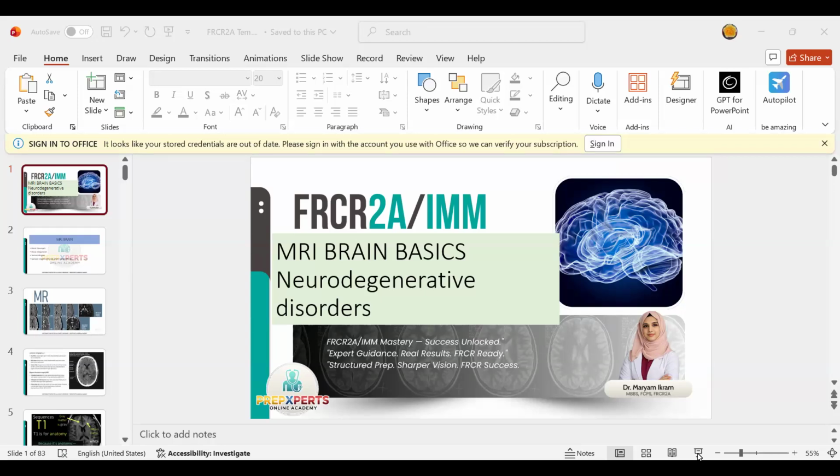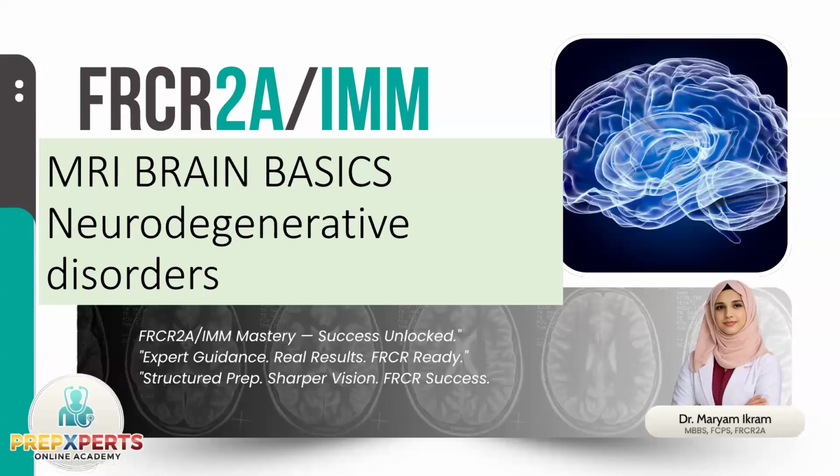So today we will be discussing MRI brain basics, some important sequences, some special sequences, some anatomy overview, as well as neurodegenerative disorders. The way I am trying to design the lectures is that we should be able to cover at least 4 to 8 questions that come up in the exam from the topic that we will be discussing.